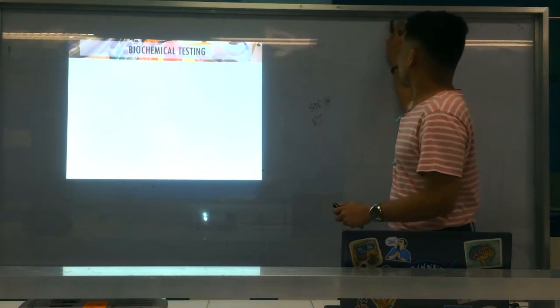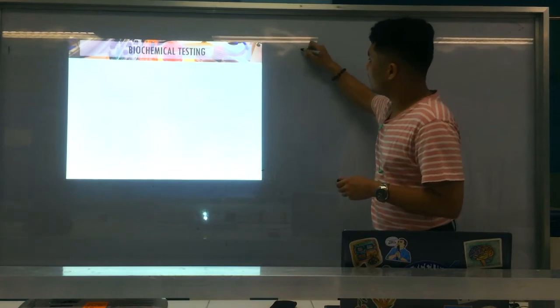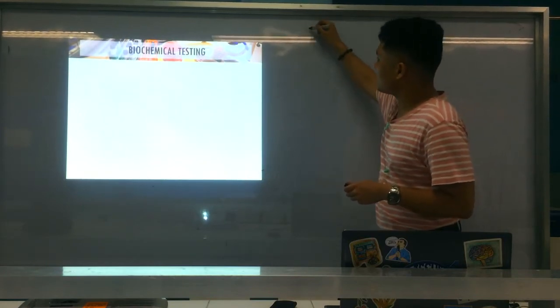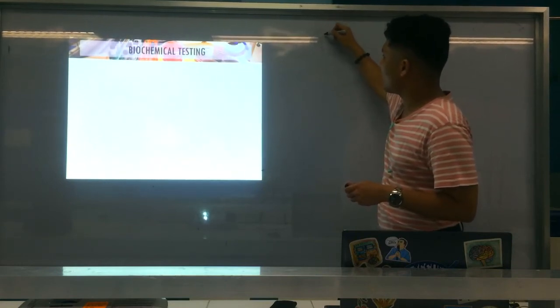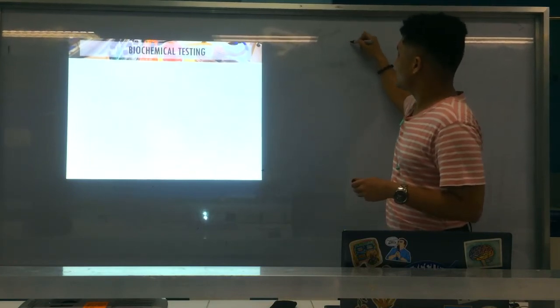Alright. So again, ania ako'y mnemonics ana to determine, you have SB TF. Okay? So this is slide coagulase. So, yung ginadetect is bound. And T is tube. Yung ginadetect is free.